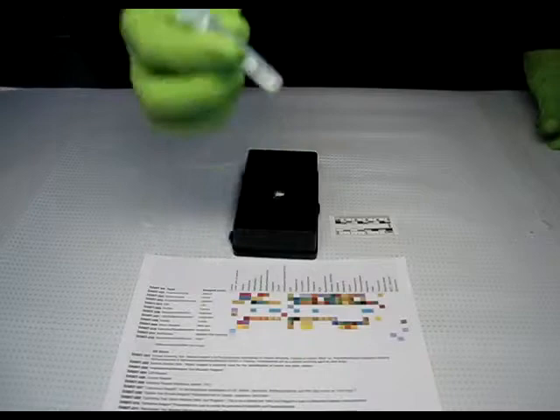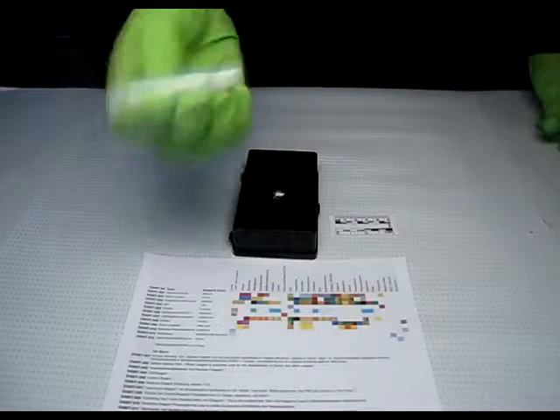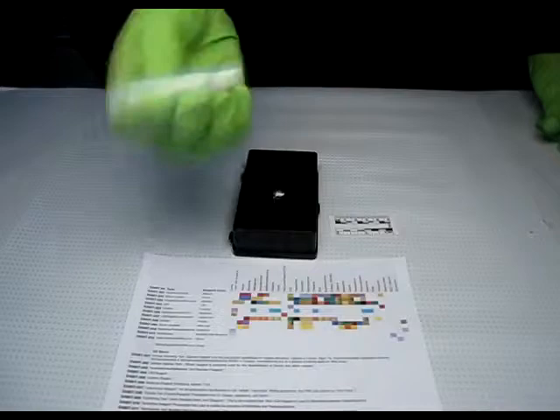Look for a color change on the sampler tip. Consult with the color chart. In this case, the color closely matches buprenorphine.